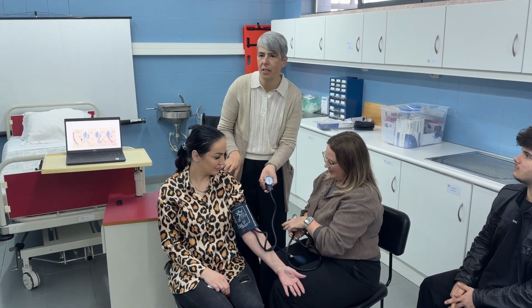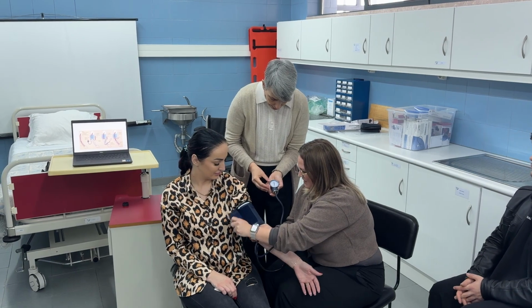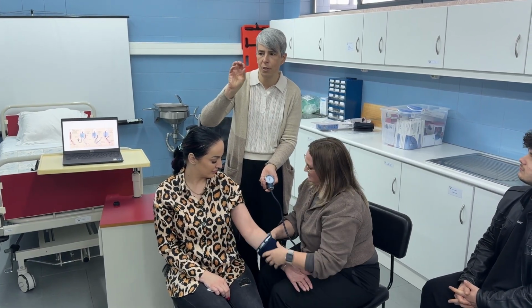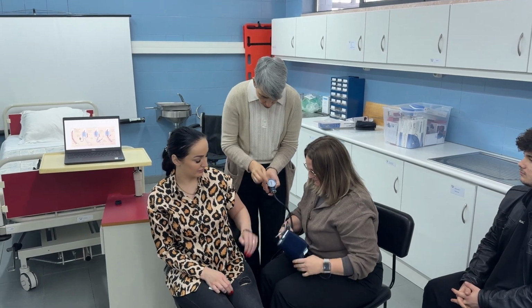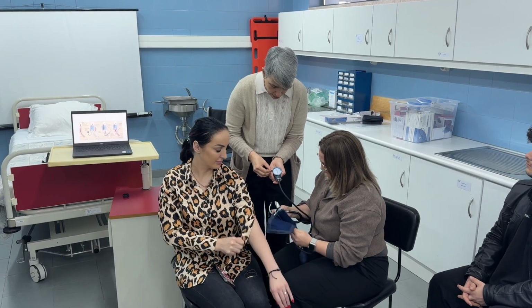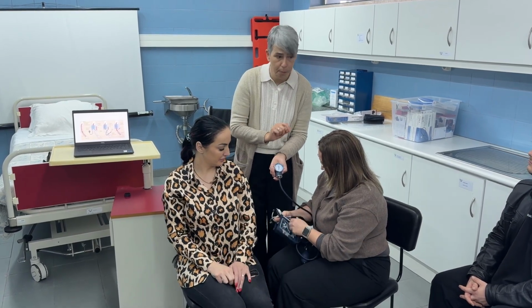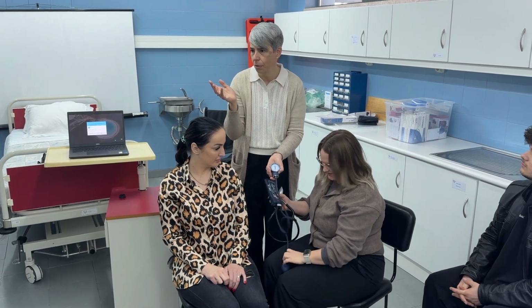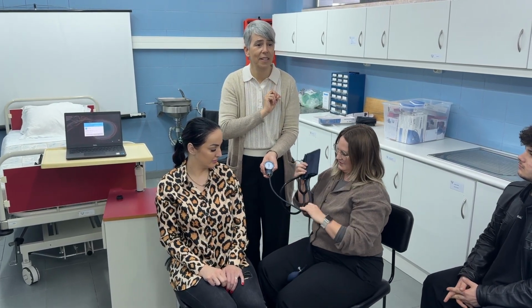She already mentioned it is a bit low. And then it stopped. She hears the heart pounding, tuk tuk tuk. She lowers the pressure in the cuff at the same time. And when it was at 70 millimeters, the sound disappears. So that's 110 over 70.